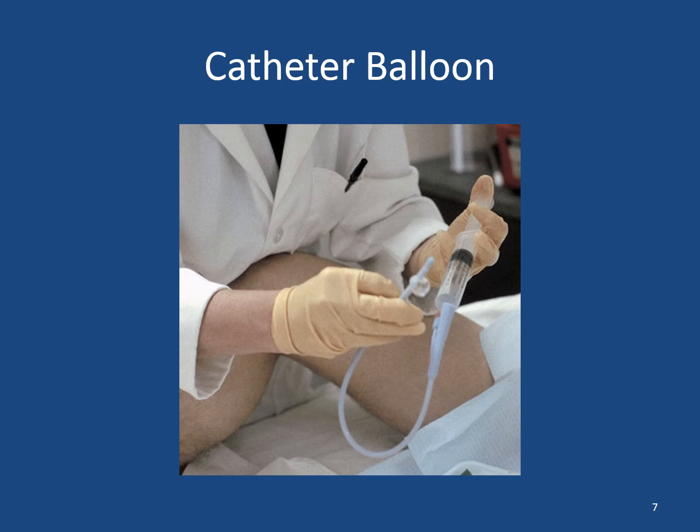Some catheter manufacturers and facilities no longer recommend pre-testing the balloon, which is where you would fill it with the solution and then pull it outside of the patient to make sure that the balloon isn't leaking and that it will fill up correctly. Most manufacturers no longer recommend this because it can actually create little ridges on the catheter itself that can cause more trauma when we're placing it.